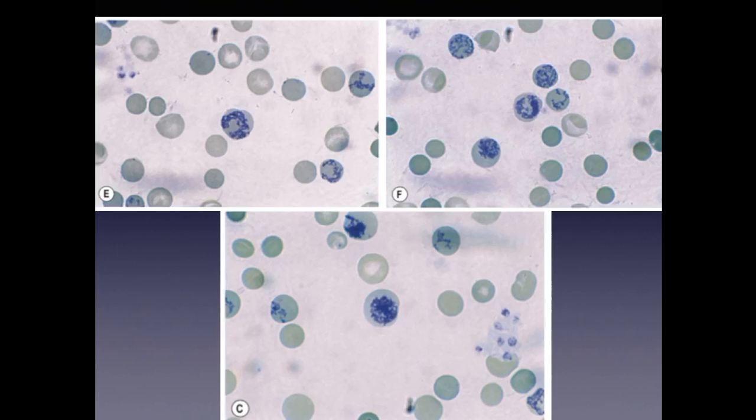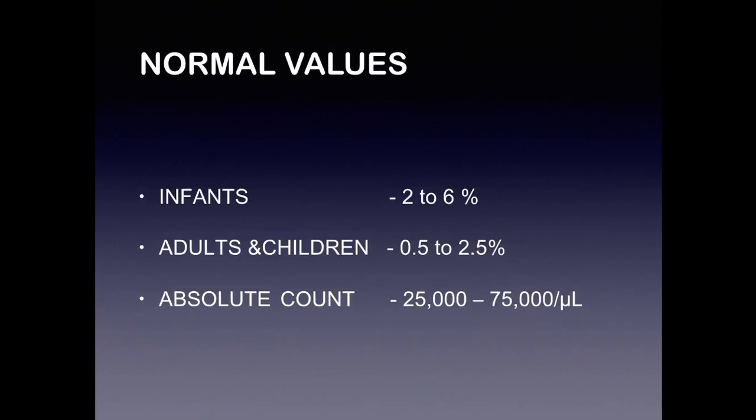The greenish cells you are seeing are the normal RBCs, whereas the RBCs showing those bluish filaments or granules are the reticulocytes, which are the immature non-nucleated RBCs. This is how it looks once it is stained by brilliant cresyl blue, which is a supravital stain. We need to count the number of reticulocytes per 1000 RBCs and then express them in percentage.